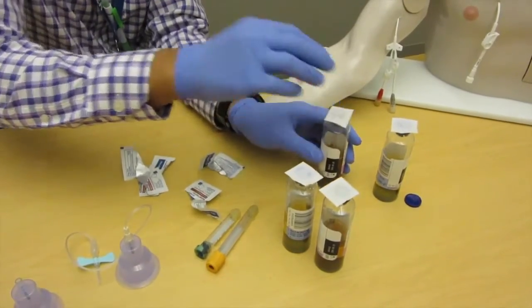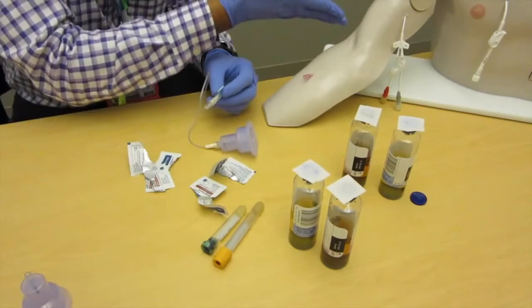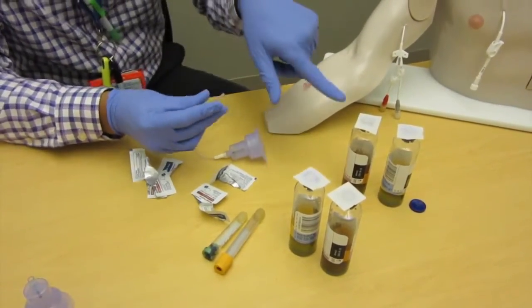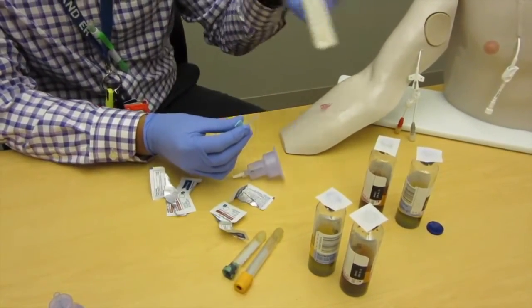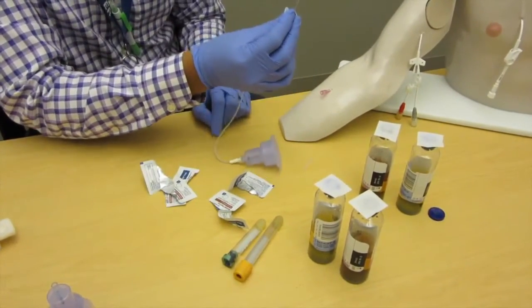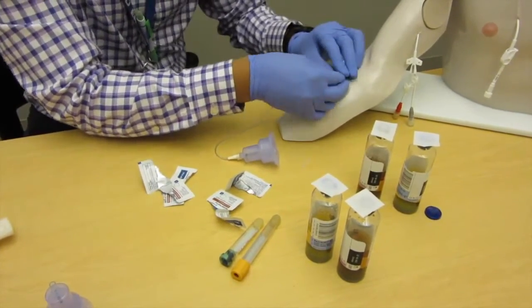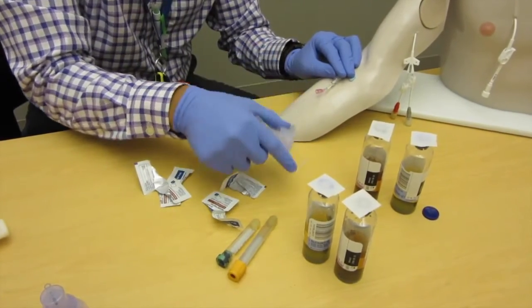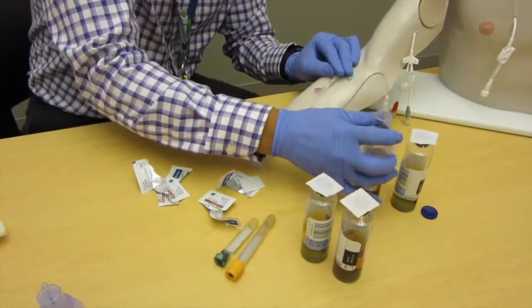I'm not going to stick this arm—once again, 30 seconds scrub, 30 seconds dry, no fanning, don't use your glove finger. Make sure you put some alcohol swabs on there and don't use the same chloroprep scrub that you use to scrub the arm to scrub the bottles. It goes right in. I'm not going to do this right now because I'm not going to draw any blood because this arm is not built for that. But once you get flashback, this is what I was talking about earlier.